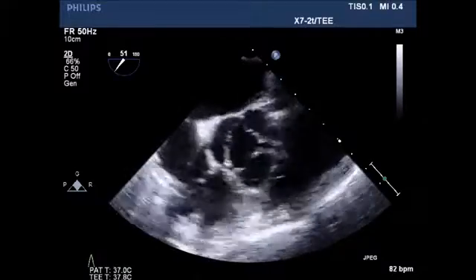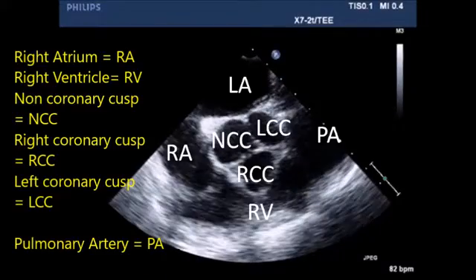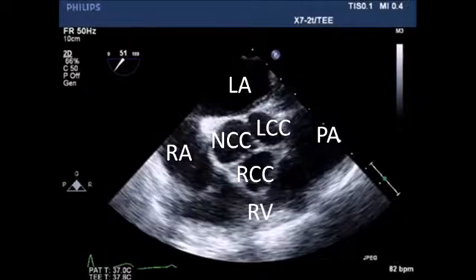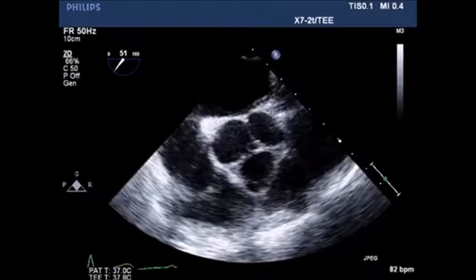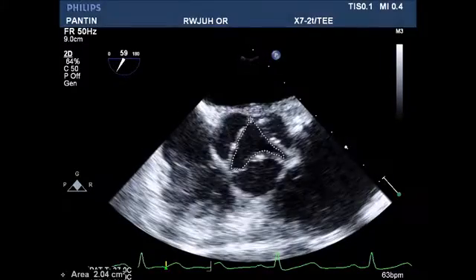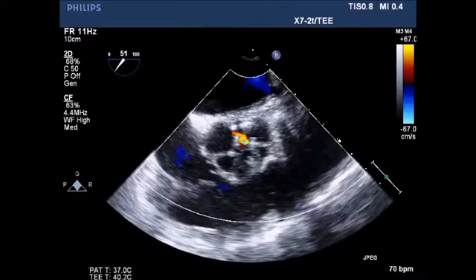Short-axis view of the aortic valve demonstrates some restriction in opening between the left coronary cusp and right coronary cusp, as well as some lack of coaptation between the three leaflets. Planimetry of the aortic valve was done with an area of 2.04 centimeters squared.